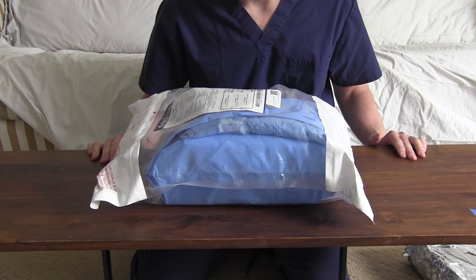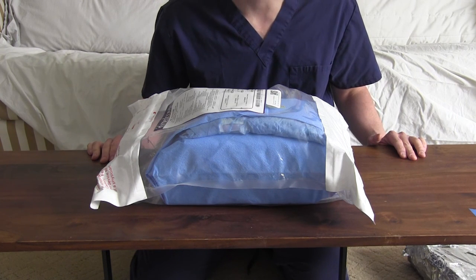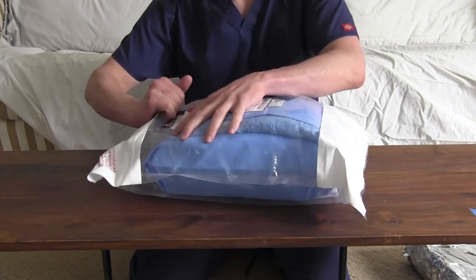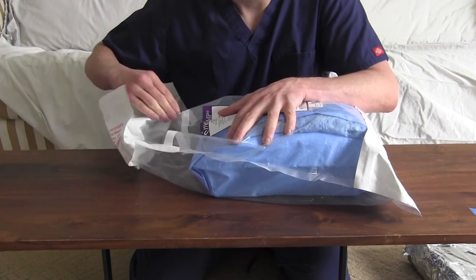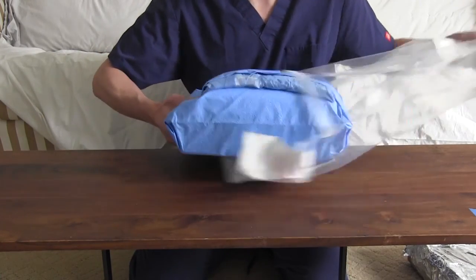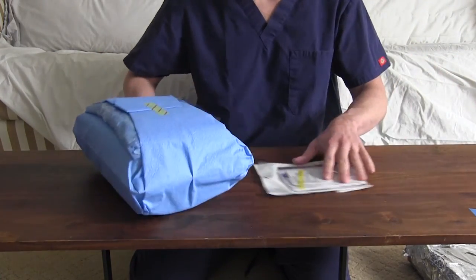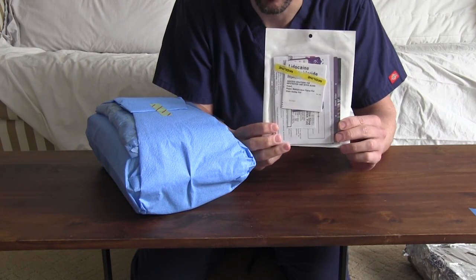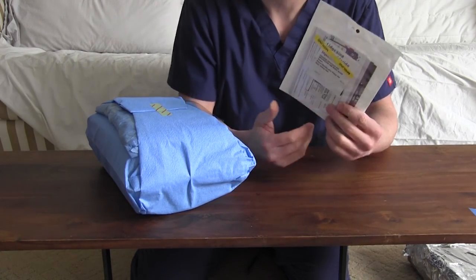So I'm going to take you through the kit. It's a pretty extensive set of steps, none of which are hard, but you've got to get them in the right order and do them properly. So let's open this bad boy up. You would have, of course, already consented the patient, put them in proper position, brought an ultrasound machine to the bedside. You got your little instruction pack here. You don't need any of this for the procedure while you're doing it. You need it afterwards, so we'll put that aside.